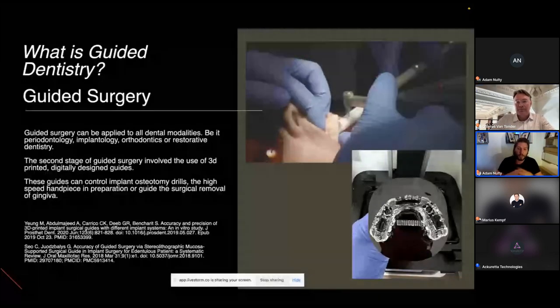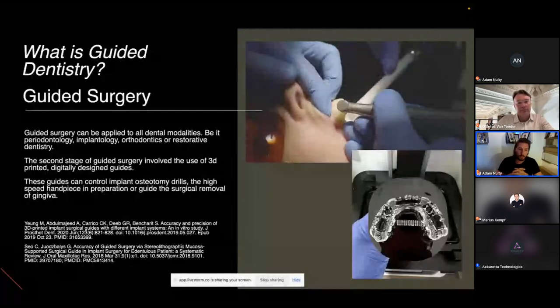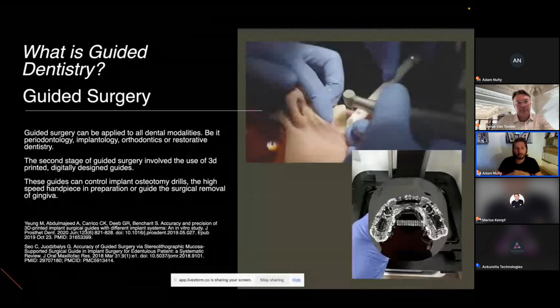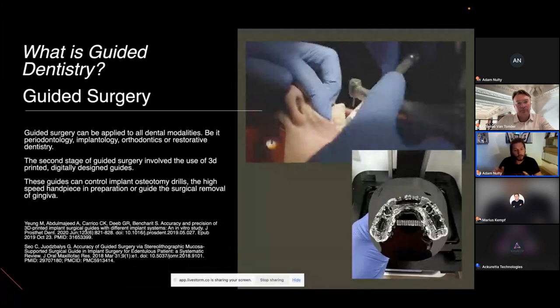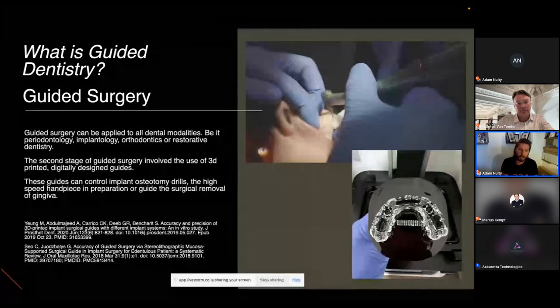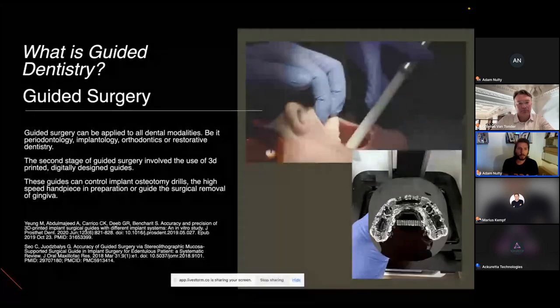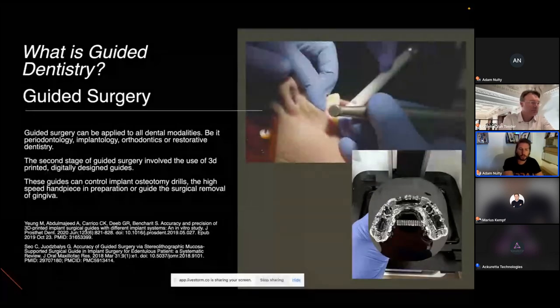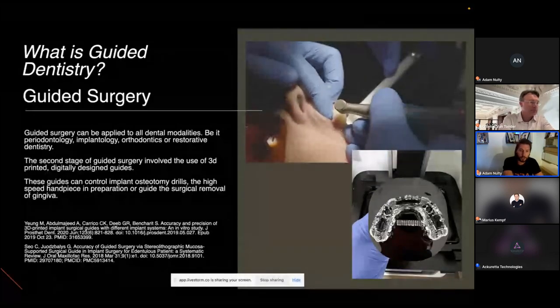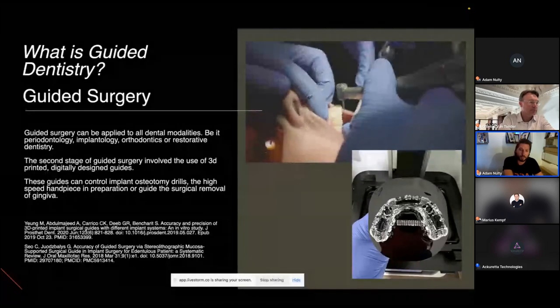So we're minimally invasive. We're only taking away the smallest amount of tooth tissue, or indeed we're able to print something so thin that we can add it to the patient without even preparing the teeth, which in some situations now we can do. So the reality of guided surgery is that it isn't just surgical guides that we can use it with, it's the whole of dentistry to guide every step of the way.